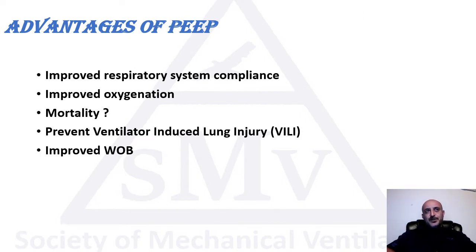So the advantages of PEEP, as we talked before, if applied correctly, you would have improved respiratory compliance, improved oxygenation, mortality, and that's a question mark, because the literature is not very clear about that, or contradictory sometimes. If again you apply good PEEP, you might prevent ventilator-induced lung injury, although as we mentioned in the previous slide, I think whatever level of PEEP you're applying, you might cause lung injury in one zone, and it would be good in another zone. If applied correctly, you might improve the work of breathing of the patient.